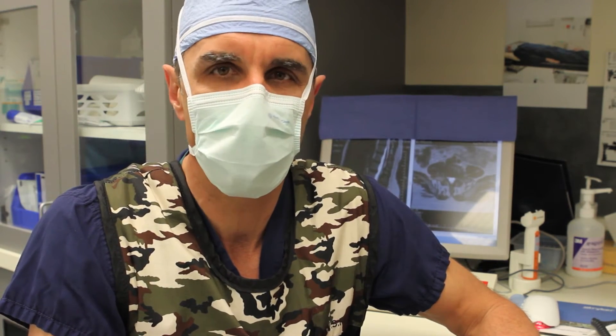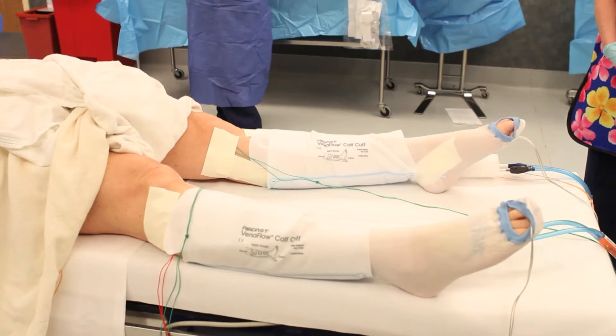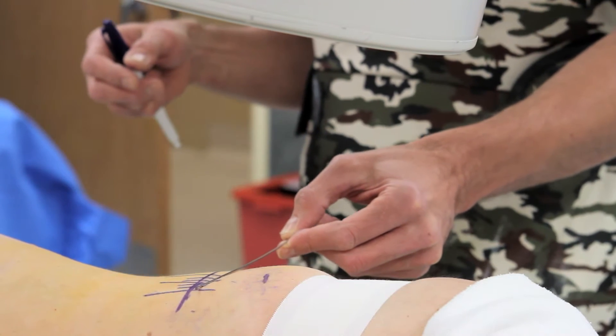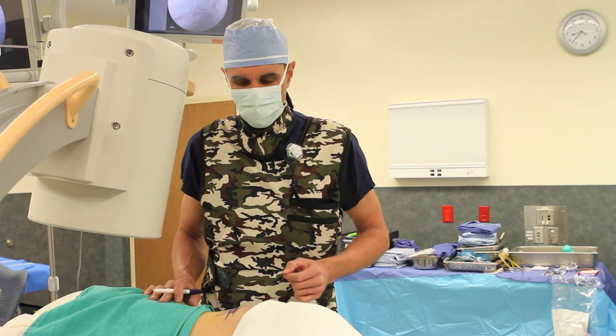It's going to be done first by lateral approach and then by percutaneous pedicle screws posteriorly. Once the patient is asleep, EMG electrodes are placed on the patient's legs for safe intraoperative monitoring of the involved nerves. For the lateral approach fusion, the patient is positioned on their side, typically on the right side to bring the left side up.